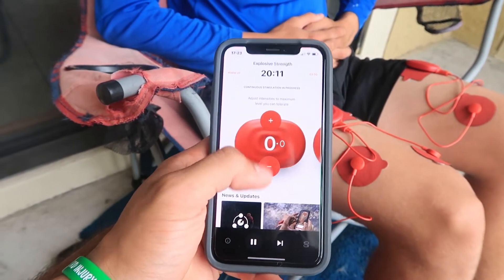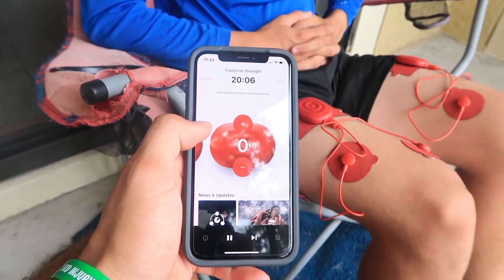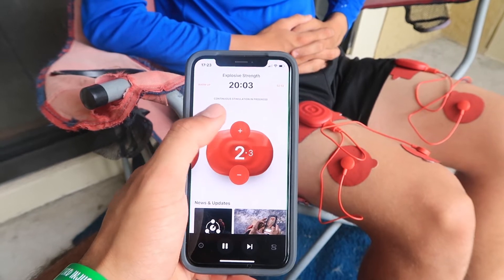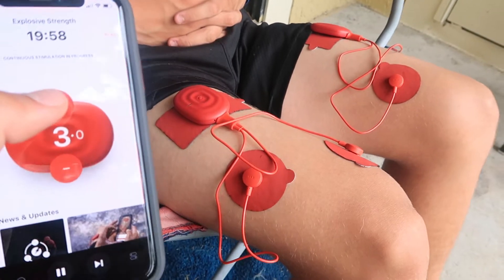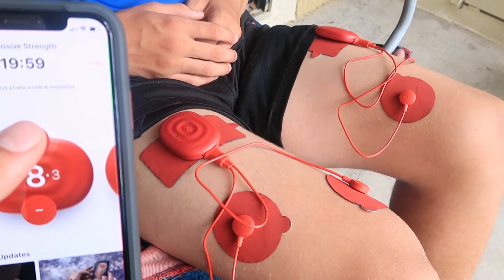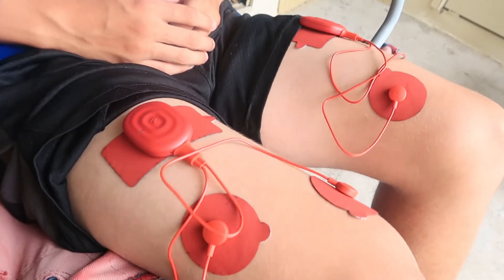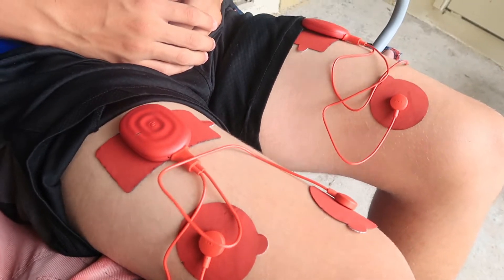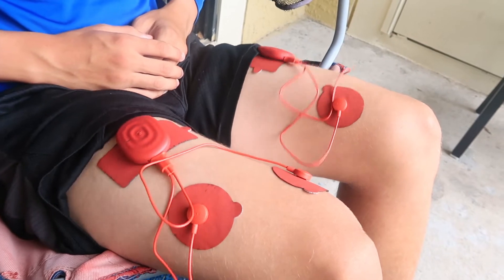I'll press the plus sign for the voltage to go up, and as I go up you'll see his legs start to shake — there it is. I'm at 8.3 and it's giving a big jump to his muscles. He's not doing any of that himself — it's all done by itself, he's completely relaxed. And there it goes, see — now it's going faster. So right now it's kind of just warming up the muscles.